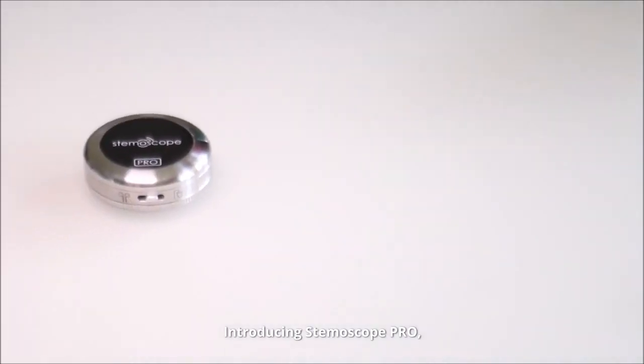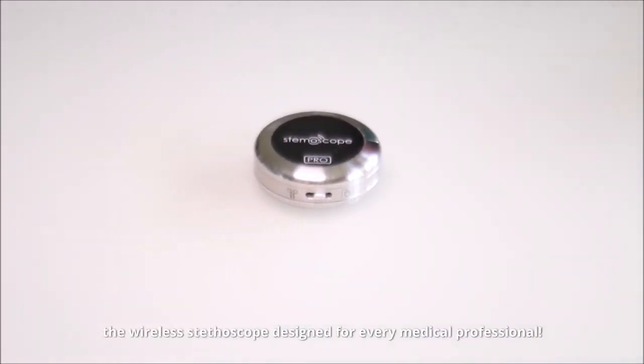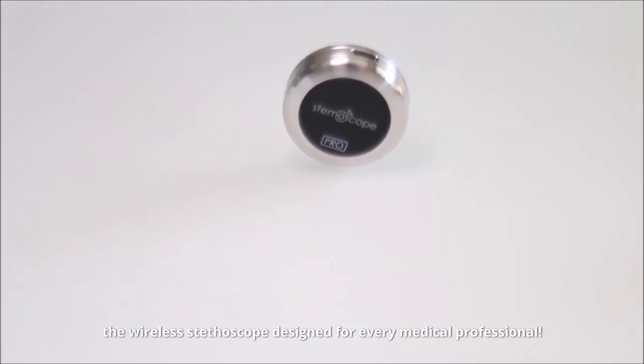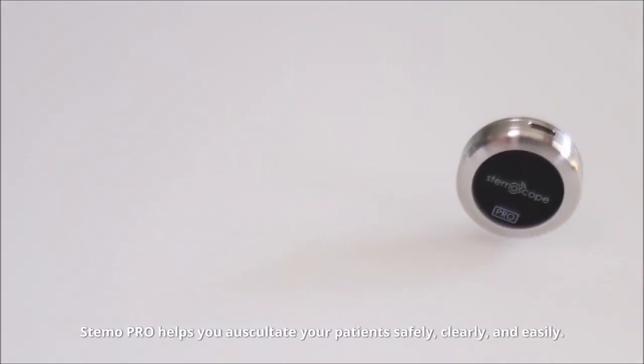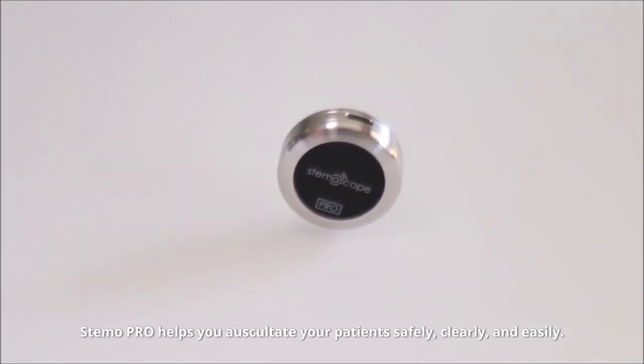Introducing the Stemoscope Pro, the wireless stethoscope designed for every medical professional. Stemo Pro helps you auscultate your patients safely, clearly, and easily.